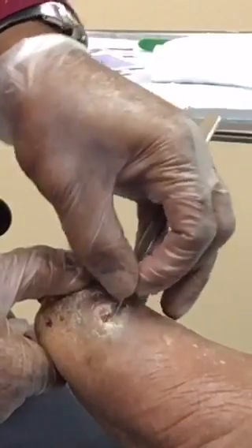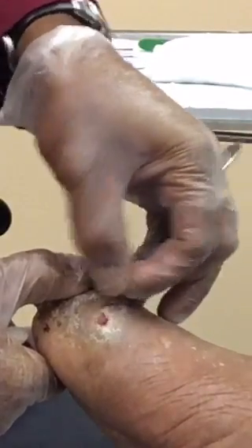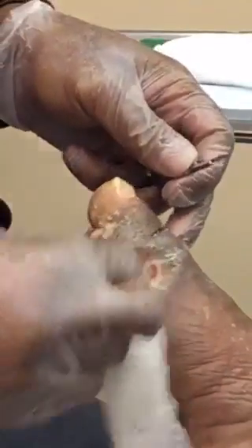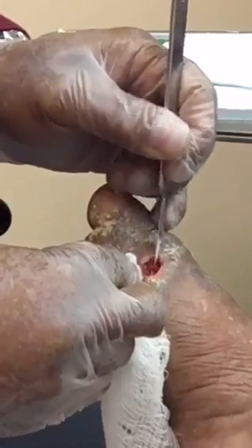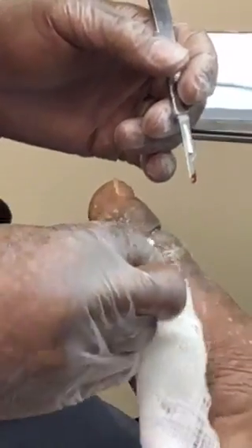What I'm doing now is taking off this fibrotic tissue — this yellow stuff that impedes the progress of the wound. As you can see, now that the yellow fibrotic tissue is off, you see a nice red base of the wound. That's what you want before you apply any graft. If you don't have that, the graft doesn't have a good surface to adhere to, and it will not work.